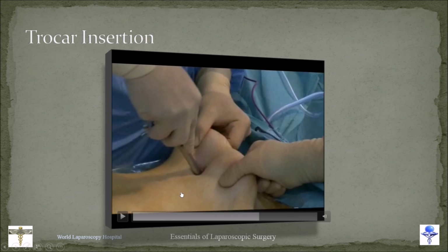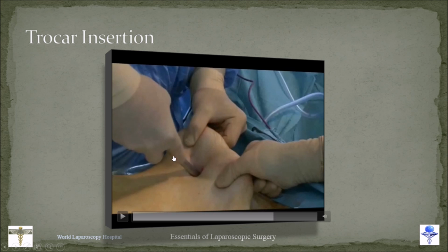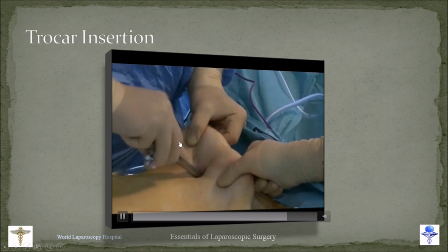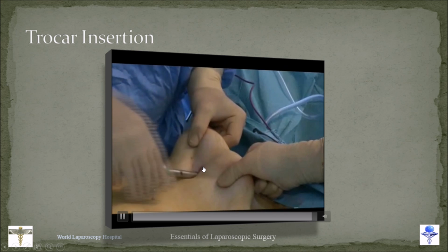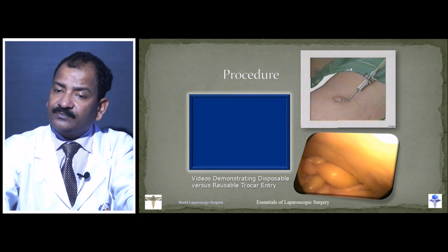So, this is blind trocar insertion, and then lift it and screw it, and screwing should be on the axis, it should not make an arc, on the same axis, and right left right left right left right left right left you will enter into the abdominal cavity, and a smooth entry, no jerk, and it is in. So, forceful entry is one of the chances to get the complication faster.